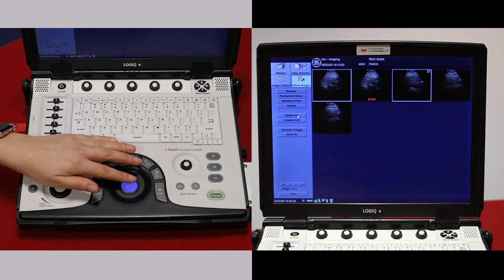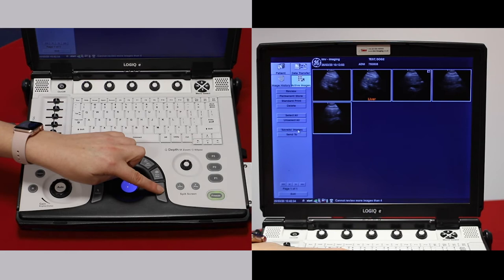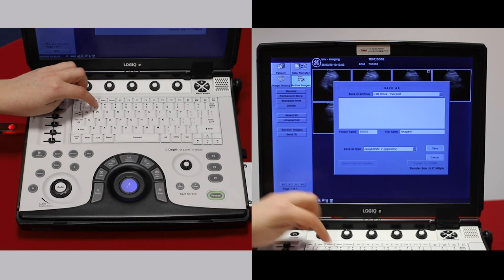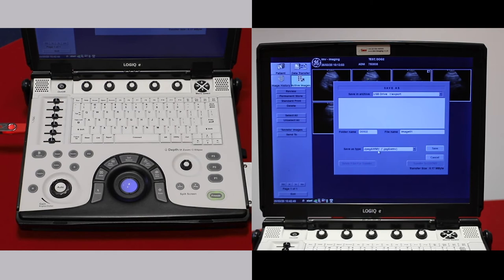Go to Save As. The computer has already found your stick. Then just pop in a folder name. This is going to save the images as JPEGs. These are compressed files, but easy to send by email. Go to Save.